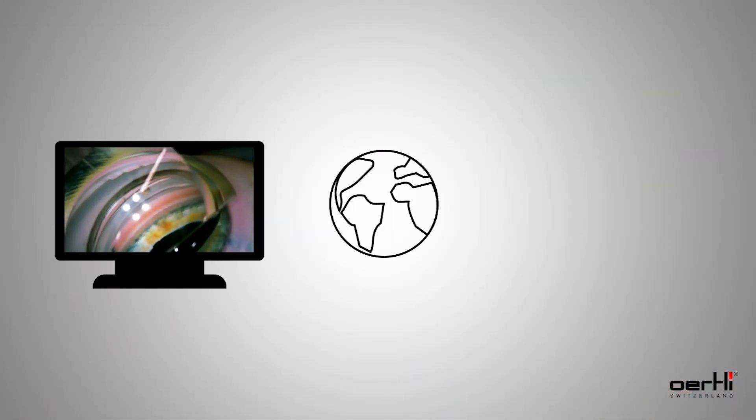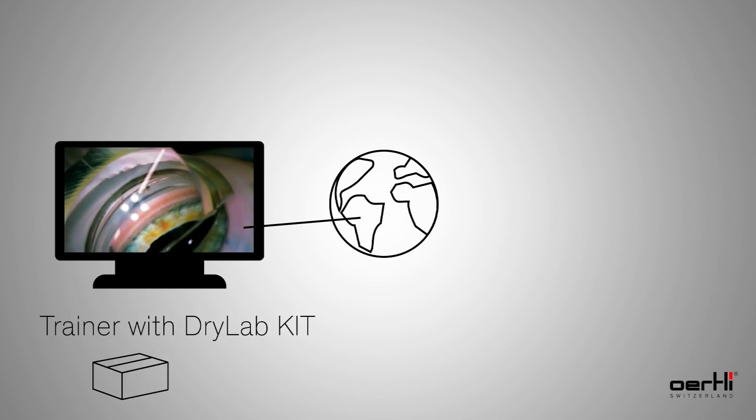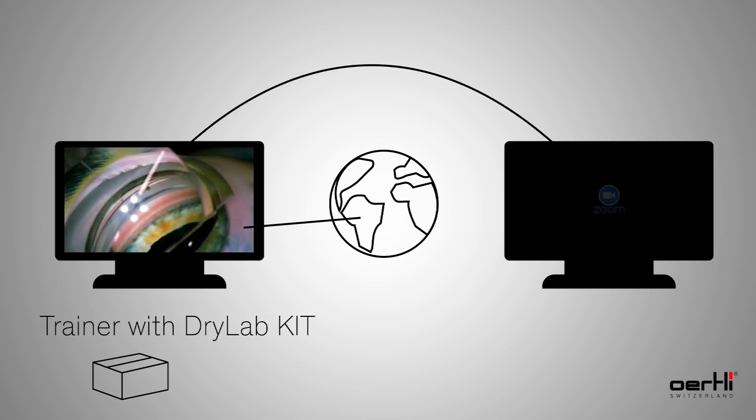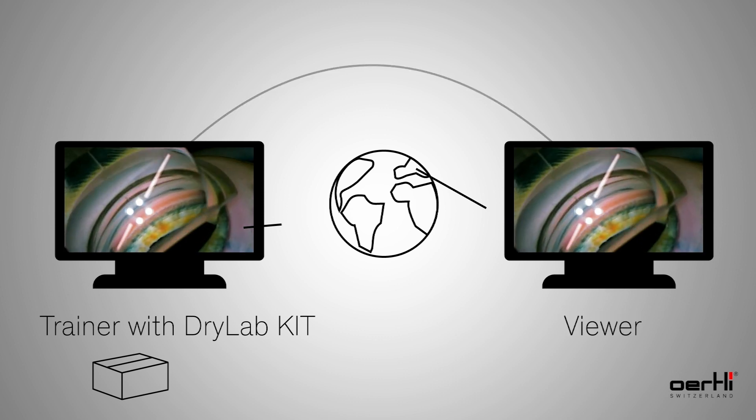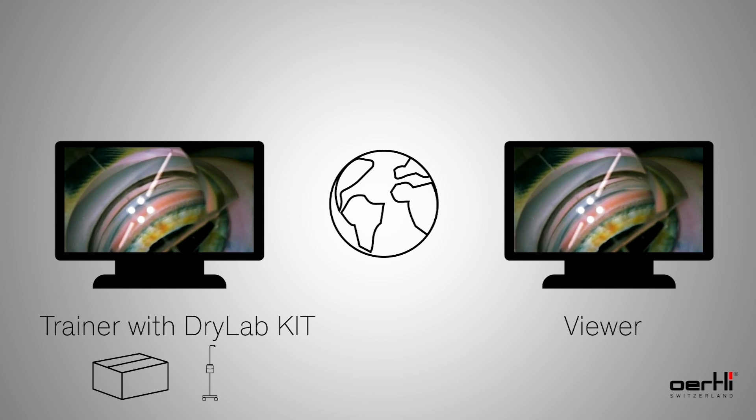And now you can demonstrate HFDS remotely to your customers or viewers. For example, you can use Zoom to show the application in real time at any location. All you need is a notebook, an earthly surgery platform like the cataract tree, and an internet connection.